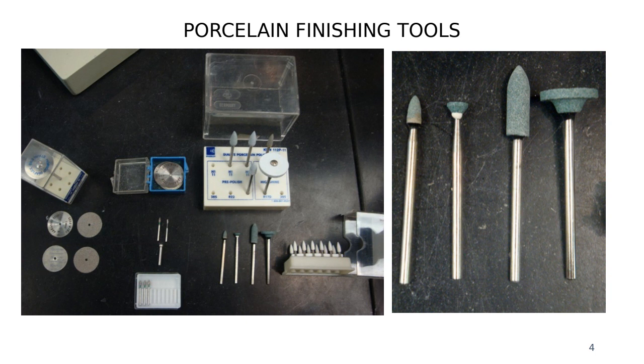And these two, we can use more on the occlusal surfaces where we have to maybe redefine the triangular ridges and the marginal ridges a little bit, okay? So all these burrs are going to help you to not only contour, but also give that characterization, right?